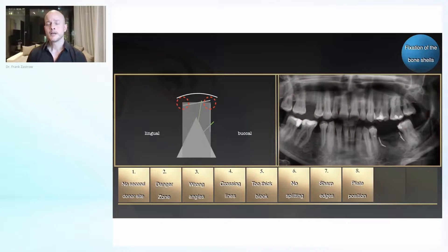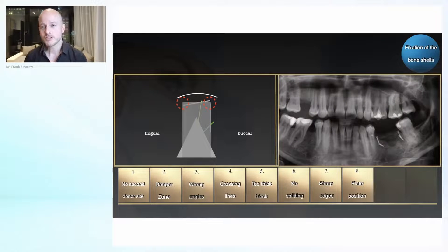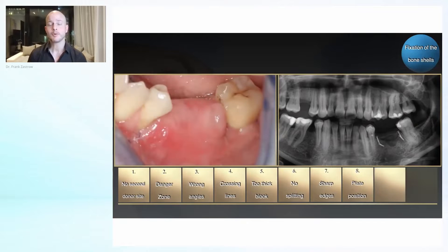The result looks quite nice, but there are two mistakes. One mistake was that I placed this plate slightly—exactly what I told you—slightly tilted towards the lingual side, so here it was standing up a little bit. This ended up causing exposure, opening, and inflammation. I'm someone who doesn't only share the wonderful cases but also shares problems when they occur.